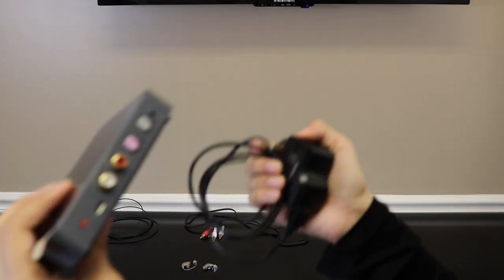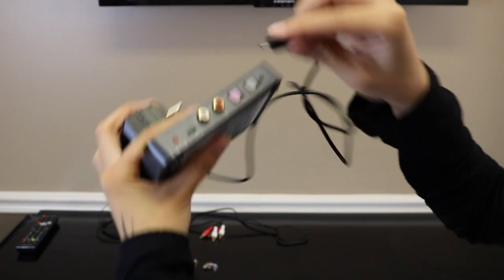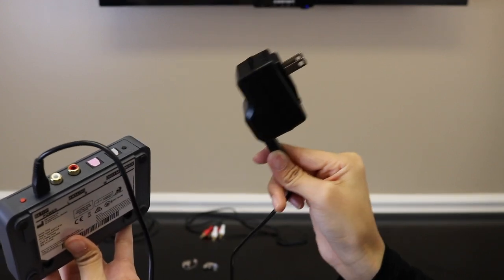The first thing you want to do is connect your TV adapter into the power outlet. Get your power cord and connect it into where it says 'power' on the TV adapter, then connect the other end into a wall outlet.